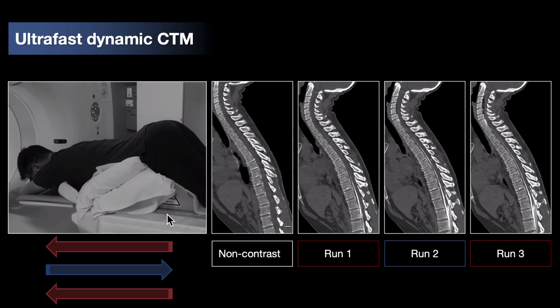And what we do is we do the lumbar puncture and inject contrast and start scanning right away up and down the spine. You can do up to 6 runs craniocaudal, but we usually find that the leak is evident by run 3, and clearly if you do 6 runs, that's a big radiation dose.